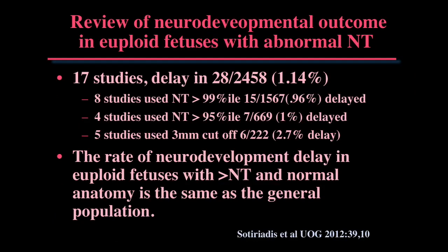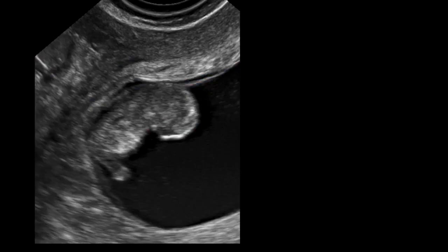So I'm going to skip through this part because it's covered somewhere else, and just end with the findings, and this is all in your syllabus if you want to go over it, about the nuchal translucency.